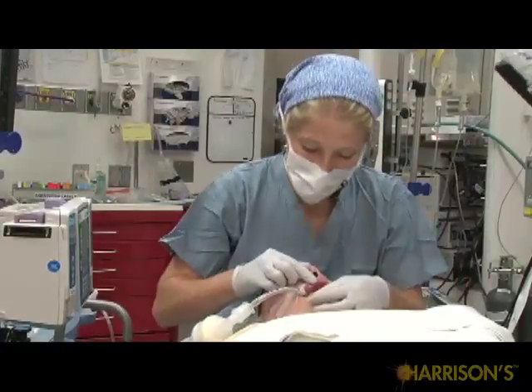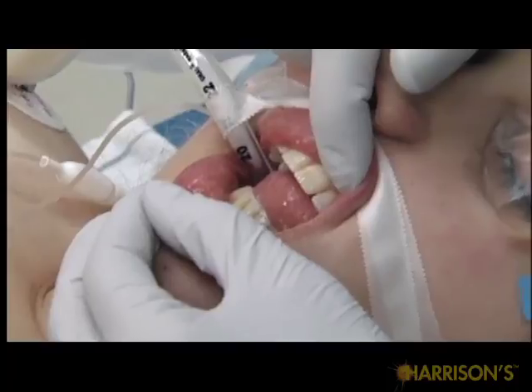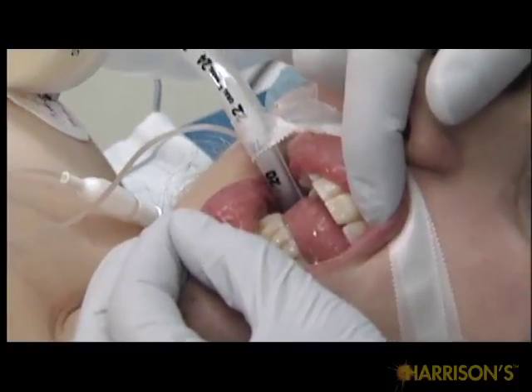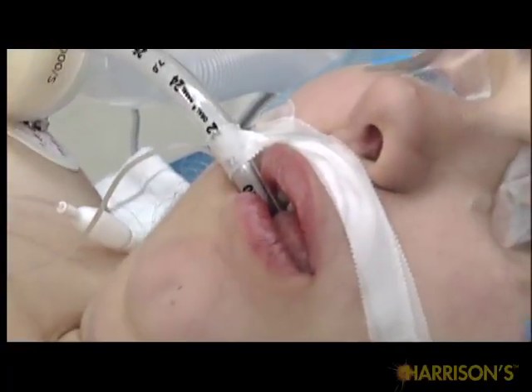You should note the depth of the endotracheal tube at the teeth when breath sounds are heard bilaterally. Therefore, if the tube gets pushed into or pulled out of the trachea, you will be aware and can re-secure the tube at the correct depth. It is also important to adequately sedate a patient once intubated to ensure patient comfort and that the endotracheal tube does not become dislodged.